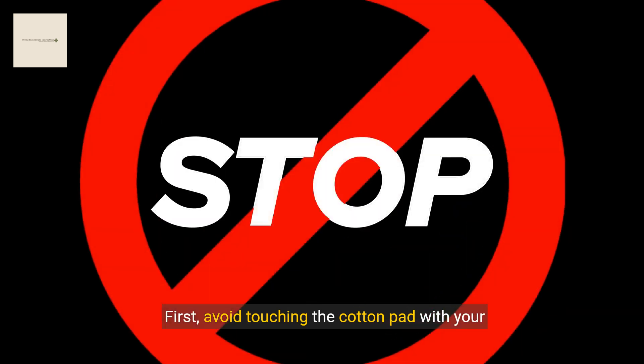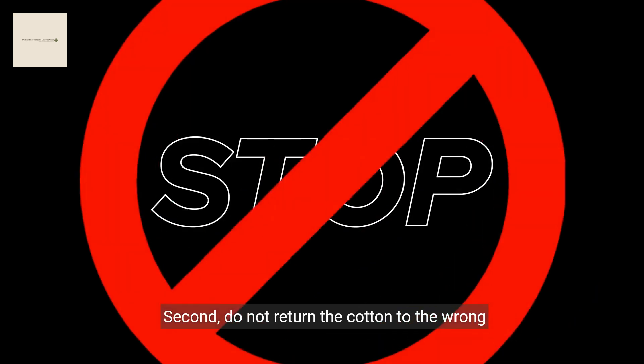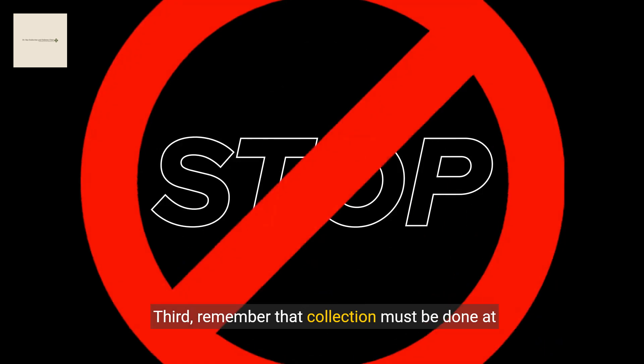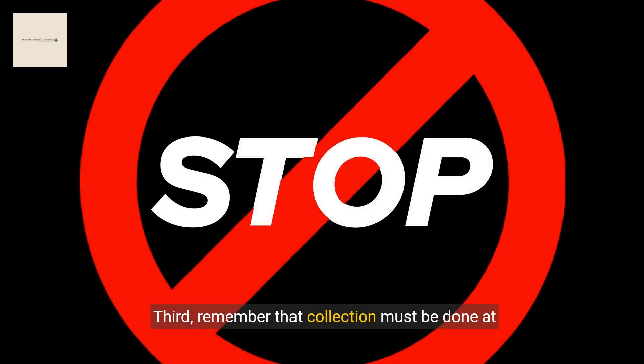First, avoid touching the cotton pad with your hands. Second, do not return the cotton to the wrong container — it should go back into the smaller cuvette. Third, remember that collection must be done at midnight unless you work night shifts or have a different diurnal cycle, in which case you should not perform this test.